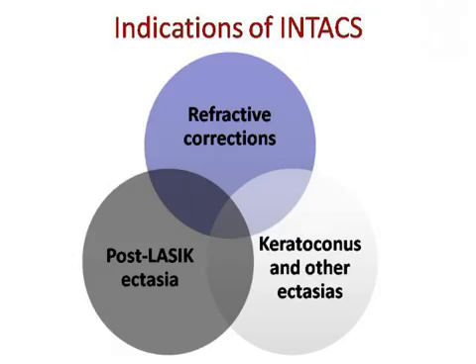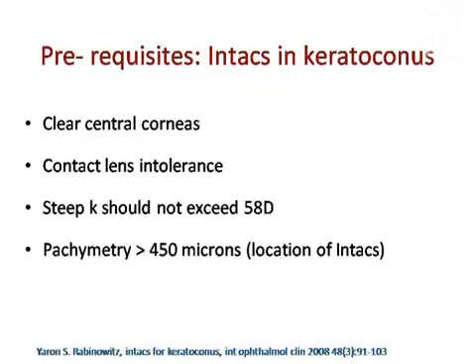INTACS has different roles in different conditions. First in refractive corrections, another is keratoconus and other forms of ectasias, and now in post-LASIK ectasia also. So what are the prerequisites for INTACS in cases of keratoconus?